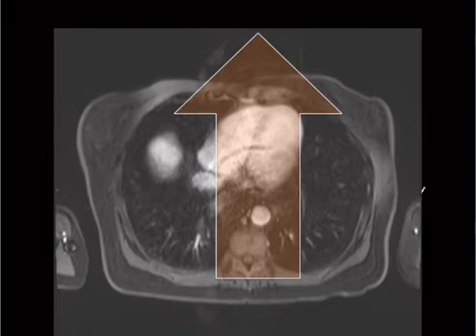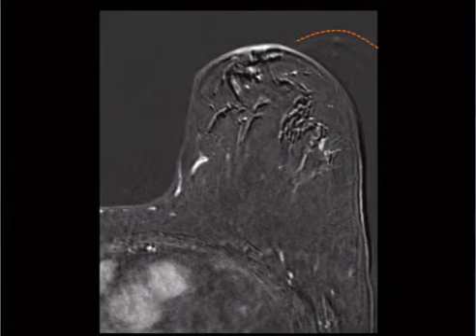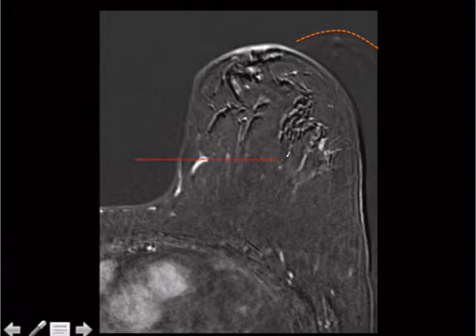few exceptions, such as breast, which I talked about before, because you have certain artifacts that occur in the phase encoding direction, such as pulsation or respiration. You can see the shadow of the heart right here out in front. Now, you wouldn't want to put that on the breast, so when you're imaging the breast, you would turn it, even though it will cost you extra time. That way, if you do have some artifacts, they occur in this direction, which is actually much less likely to occur. You're much more likely to get breathing and heart beating artifacts this way, and that's why you would do the phase encoding direction in this plane, even though it would take you a little bit longer.